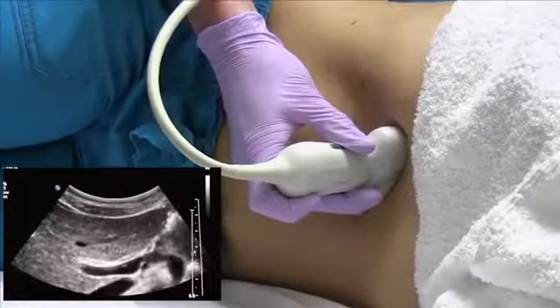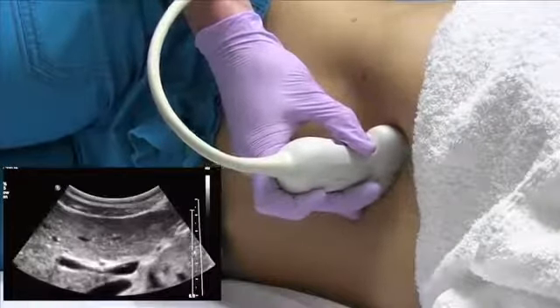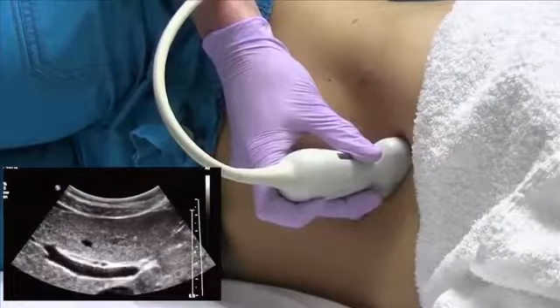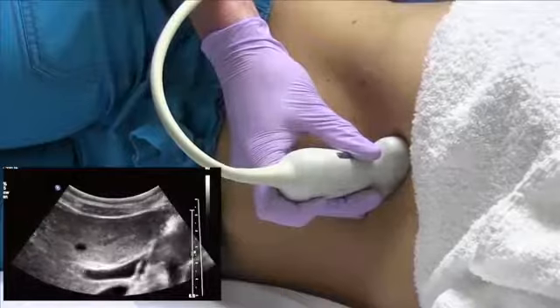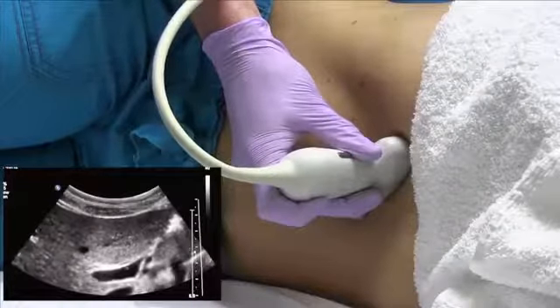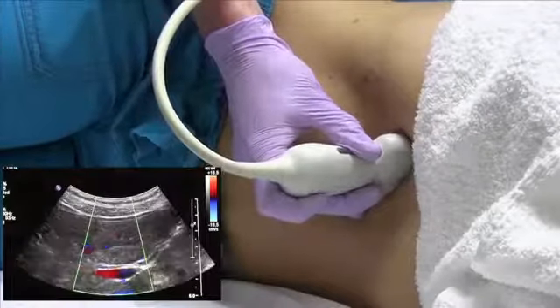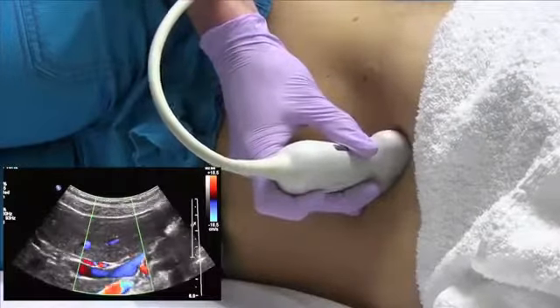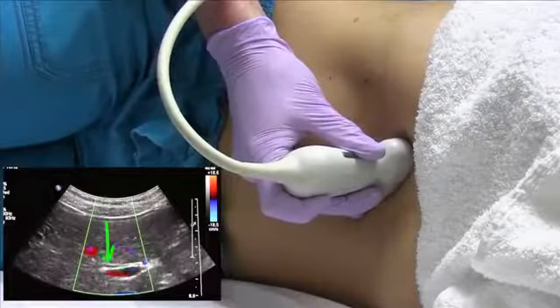So you just keep tweaking the probe until you elongate one of these tubular structures next to the main portal vein. The easiest way to see if you're on the hepatic artery or the CBD is to just turn on color and see if it lights up. If it lights up, you are on the hepatic artery, and if it doesn't, you know that's the CBD.